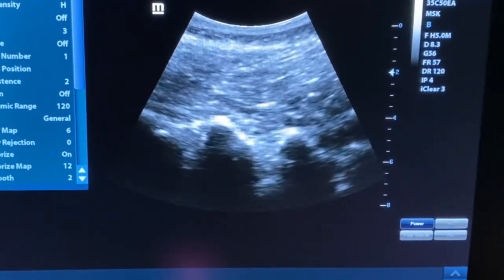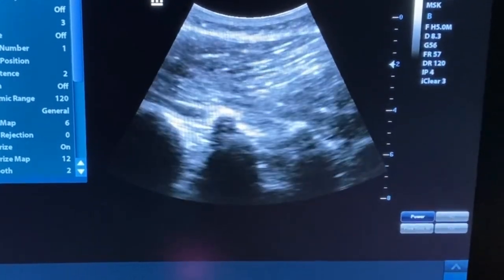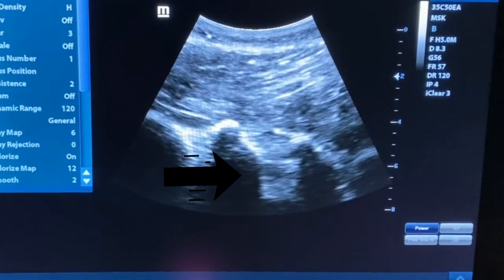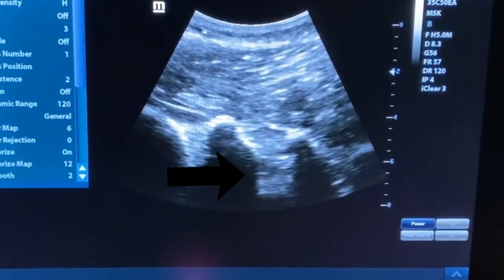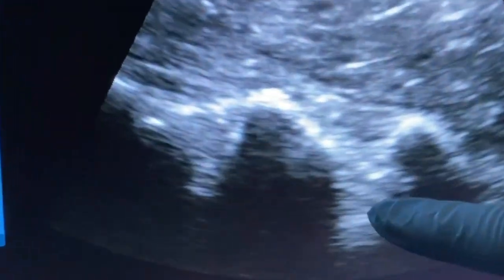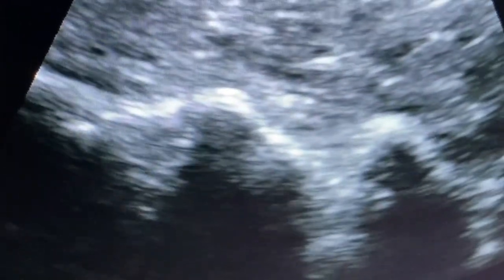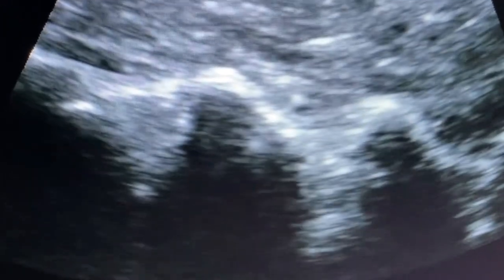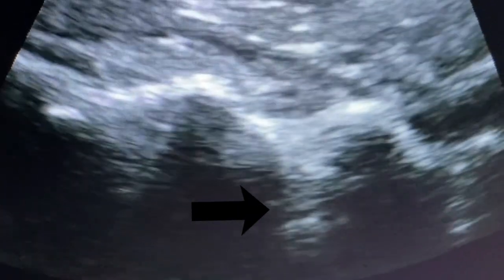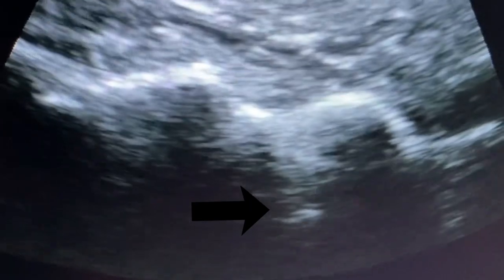Now I've redirected the needle and you'll start to see a little bit of movement higher up on the screen. As the needle gets in — there you go — you can see it all the way in between the transverse processes. I'm pointing to it with my finger. Way down in between those transverse processes is the psoas muscle, because I have to go through all the erector muscles, through the multifidi, in between the transverse processes, and then I'm into the psoas.